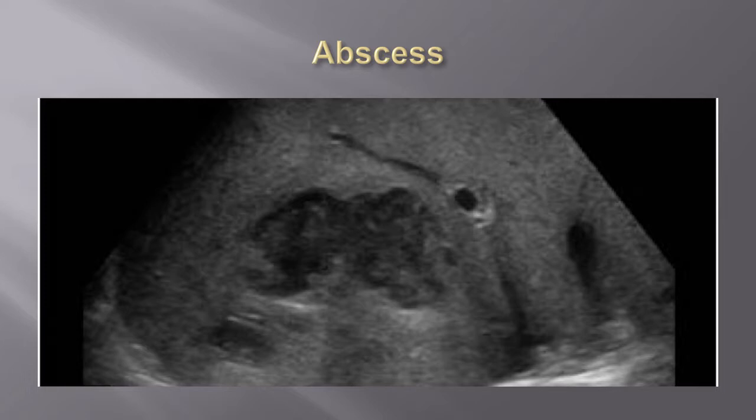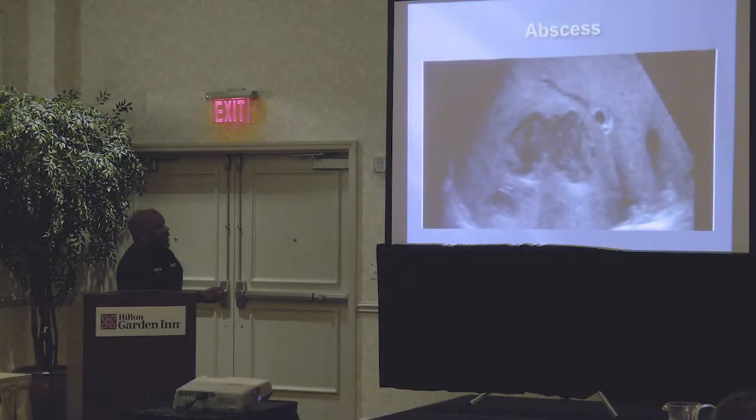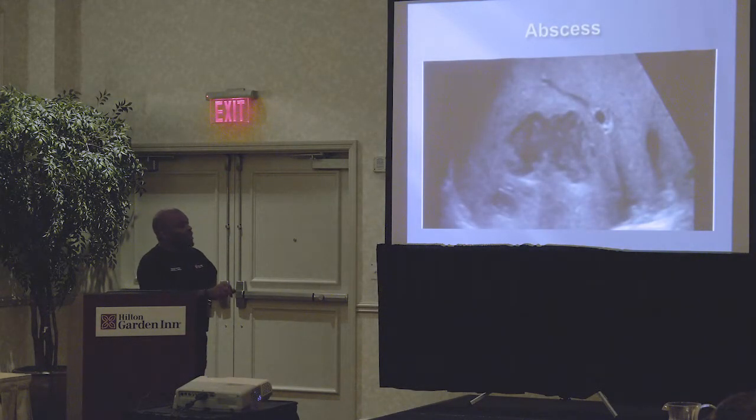But here's one thing that can be helpful. If you want to do ultrasound guidance here, you will avoid putting your needle in this blood vessel right there. You can see this is filled with blood. It's nice and black and hypoechoic. And this, not so much. So you notice it has some proteinaceous material in it because there's something in it that is reflecting sound and giving you an image.